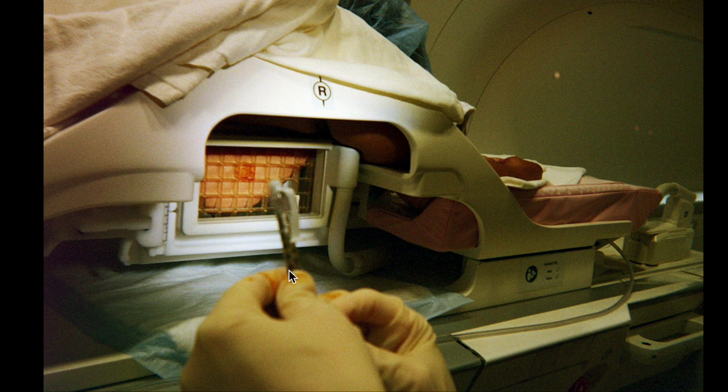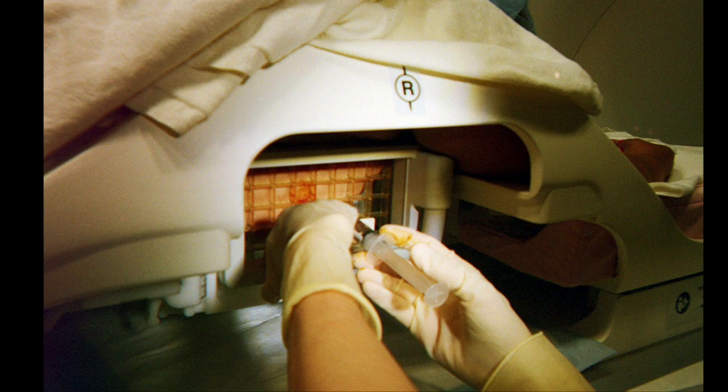I use a tuberculin syringe and give the lidocaine, and I think in that image, this area here was where I was going to go, so you numb up the area that you think you're going to be putting the needle. Then you numb deeper with lidocaine with epi.